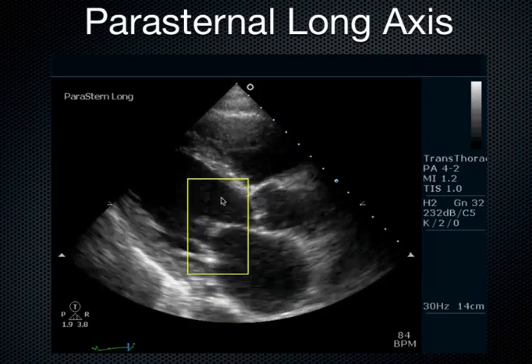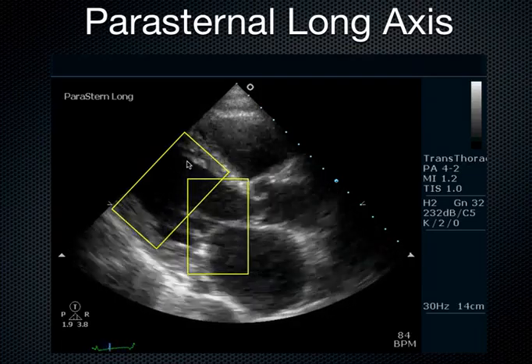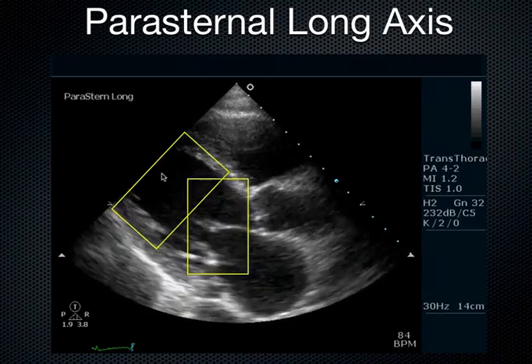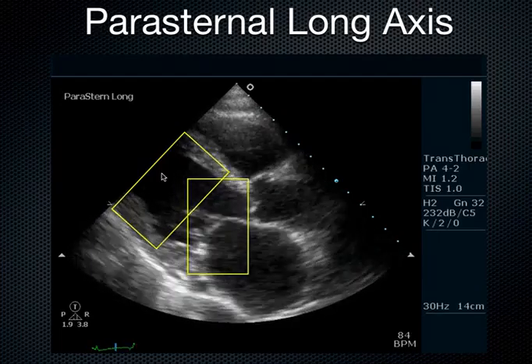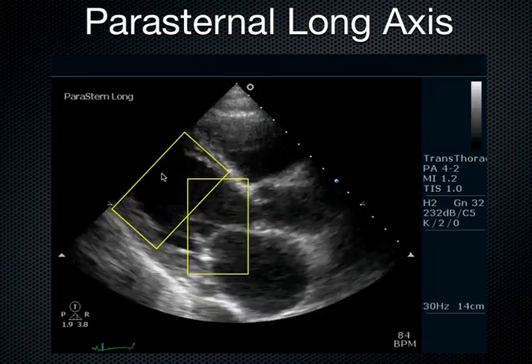Take, for example, this heart. Is the mitral valve coming up and smacking that septum? Nope. What about back here? Do we see a lot of good squeeze here? A lot of delta, or change in the chamber size, between end systole and end diastole? Nope.